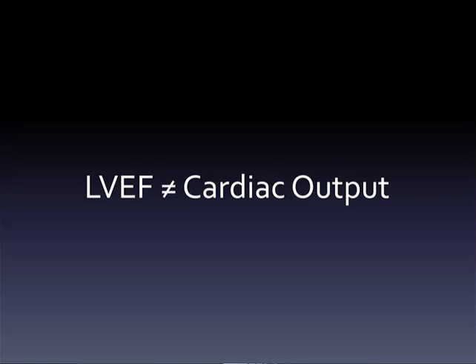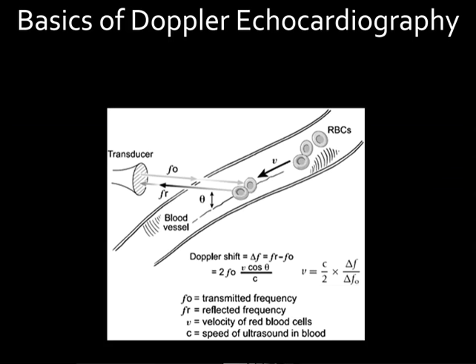Now, bear with me. I think the residents are probably a little bit more familiar with this, but we're just going to go through some basic physics of a Doppler echo, because I think it's important to understand what our limitations are.